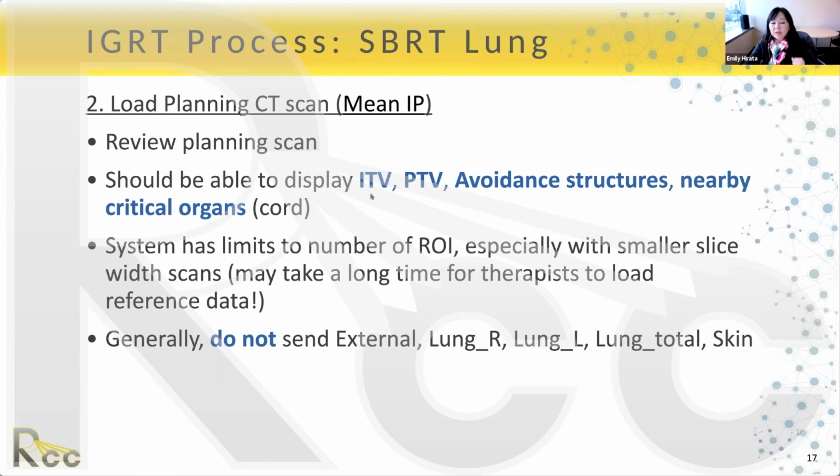Really want to send the structures that you need and try not to send super large structures, because that can actually cause errors at the machine where they're not able to load the reference set and the structures needed for the IGRT session. And when that happens, it can be a bit of a challenge where you have to go into the planning system and resend some files over to the machine, and that can be certainly stressful at the console.